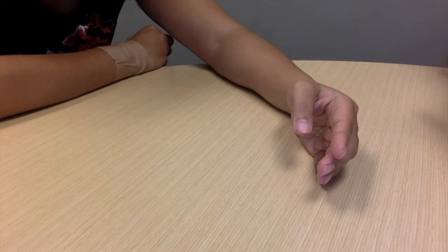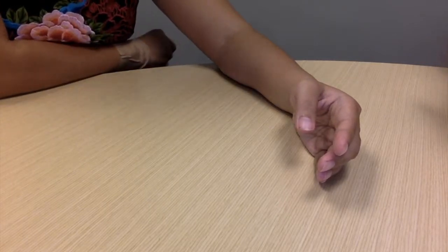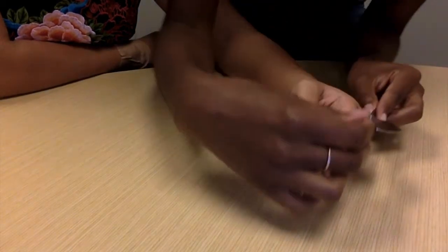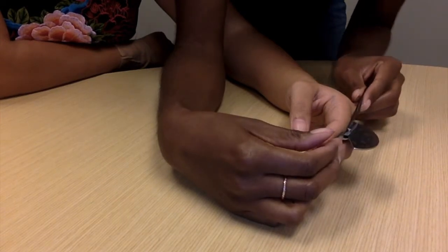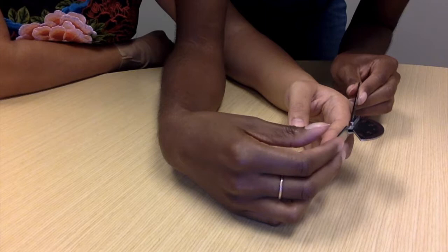For PIP flexion, the normal range is 0 to 110 degrees. The patient is seated with the forearm in mid position, the wrist at 0 degrees neutral position, and the forearm and hand supported on a firm surface on the ulnar border. The axis is placed centered on the dorsal surface of the PIP joint being measured. The stationary arm is placed over the proximal phalanx, and the movable arm is placed over the middle phalanx.